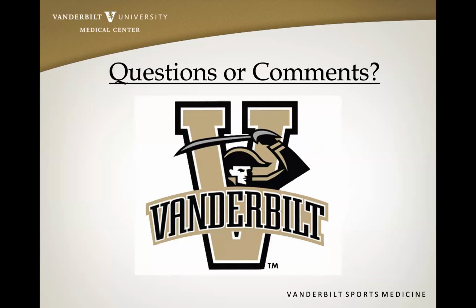I have a couple of thoughts just on this clinical scenario and ultrasound in the dorsal wrist, and then also just looking at an MRI, and that MRIs don't pick up everything. Just curious, in retrospect, if you look back at the MRI, could you pick up that ligament injury or no? No. I mean, that's what we went back to.